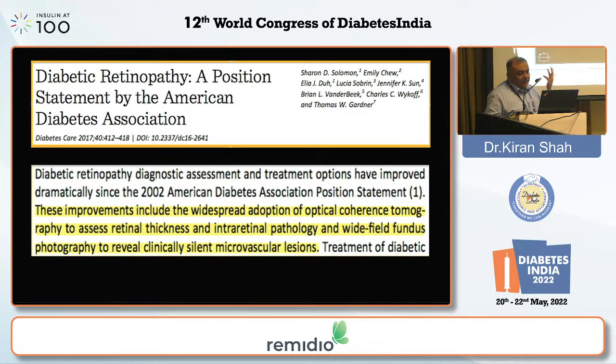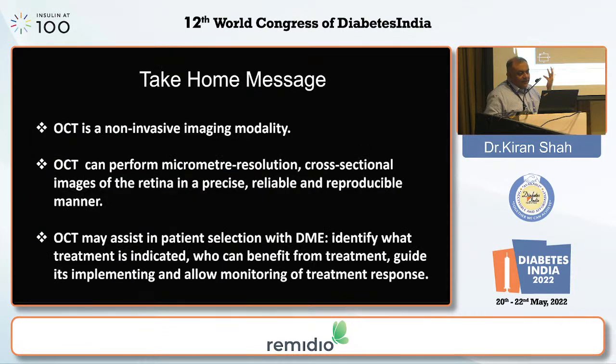And to conclude my talk, OCT is a non-invasive imaging modality. It can perform micrometer resolution cross-sectional images of the retina in a precise, reliable, and reproducible manner. It may assist in patient selection with DME, identify what the treatment is indicated, who can benefit from the treatment, guide its implementation, and allow monitoring of the treatment response.